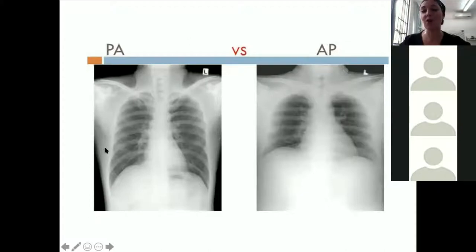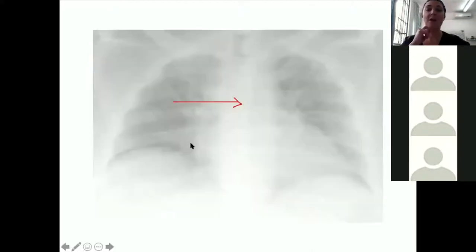It means that when you're commenting on the cardiothoracic ratio in the AP view, you've got to be aware that it makes it really difficult to comment on. So when you say, is the cardiothoracic ratio enlarged? On the AP view, you can't really comment. So think about that in the back of your mind. Okay, right. Then the next thing you want to know is, is this x-ray adequate or not? Is it underpenetrated or is it overpenetrated?